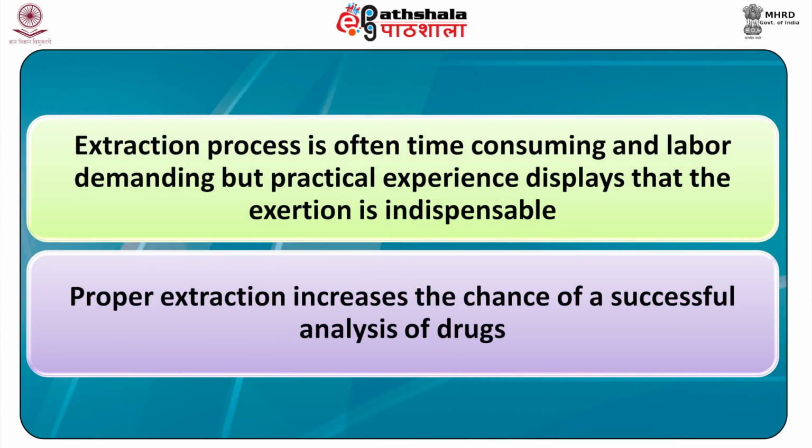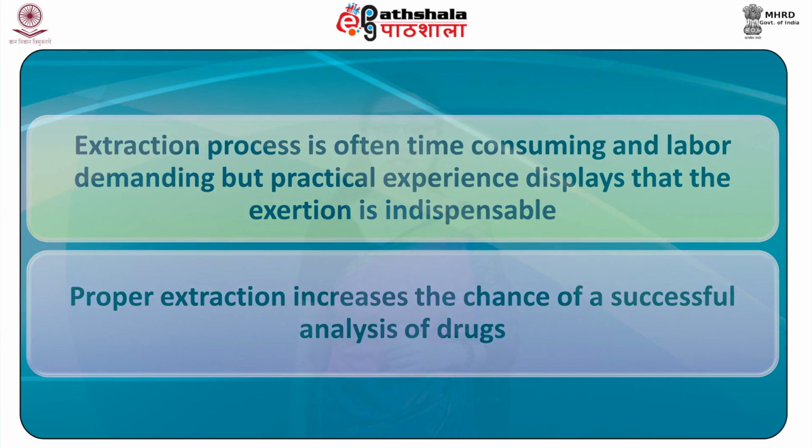The extraction process is often time consuming and labor demanding, but practical experience shows that the exertion is indispensable because the subsequent analytical steps are based on and benefit from the sample preparation. To be brief, proper extraction increases the chance of a successful analysis of drugs.